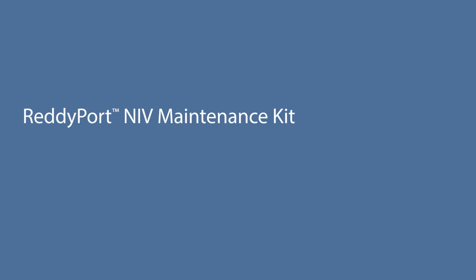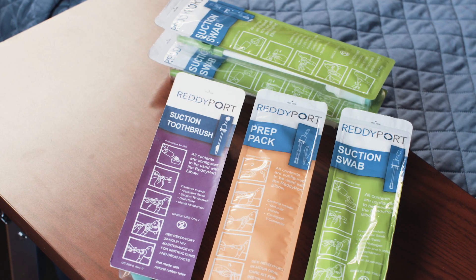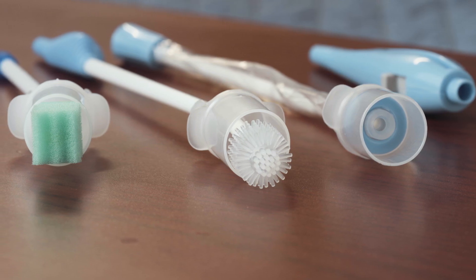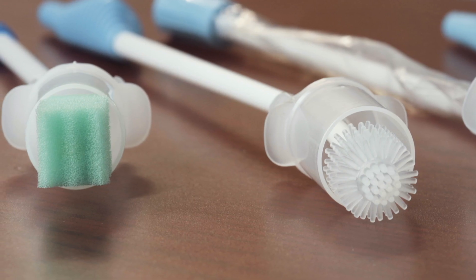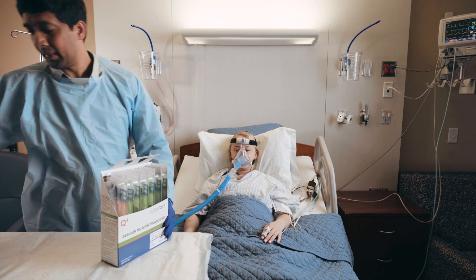The NIV maintenance kit provides the tools needed to provide best practice oral hygiene for patients, whether it's to moisturize with gel or water or to clean with the ReadyPort toothbrush and suction swab. Open the ReadyPort NIV maintenance kit by removing the cover.